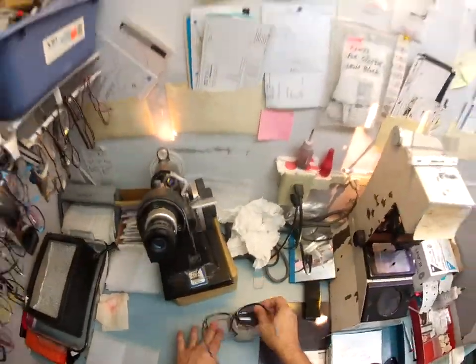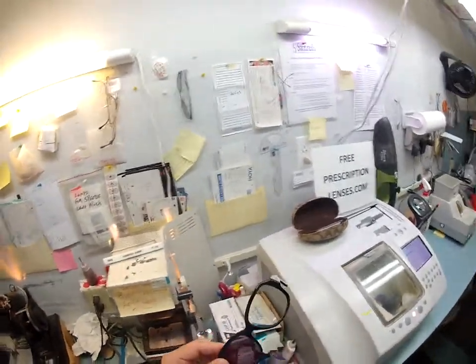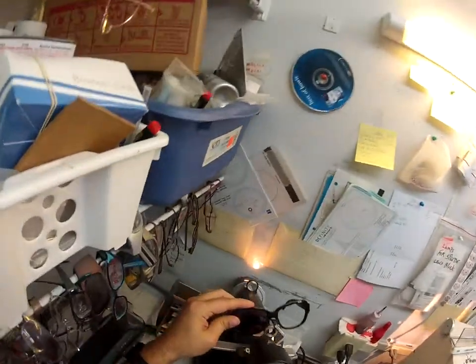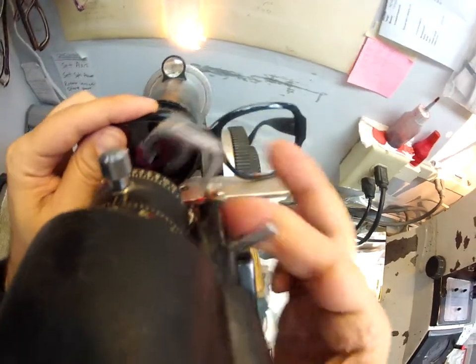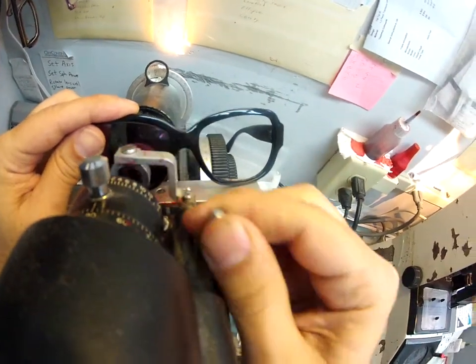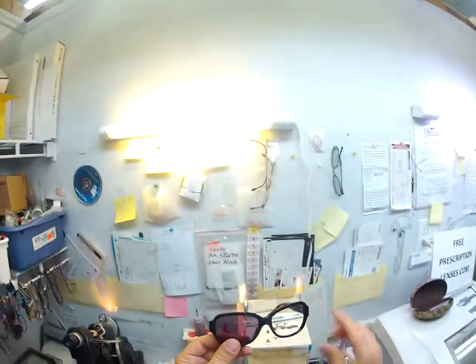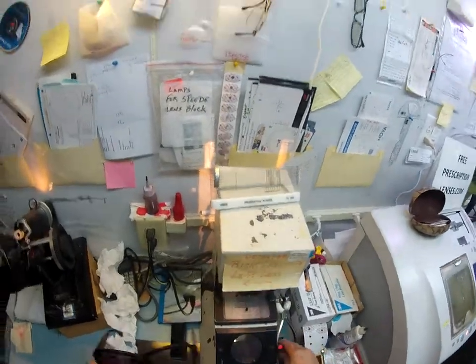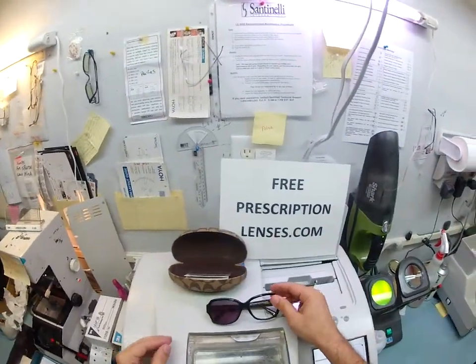So, this is done. I'm going to take the block off the lens. That is now, suction is broken. And my little red dot is gone, so I'm going to put it back in my Marco 101 lensometer. Find the optical center. Hang on, hang on, hang on. There's the center. And now I'm going to put a red dot there. Because that red dot is going to be dead center in front of your pupil in just a moment.